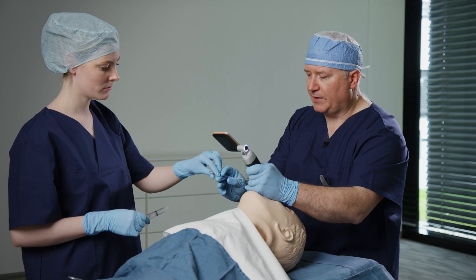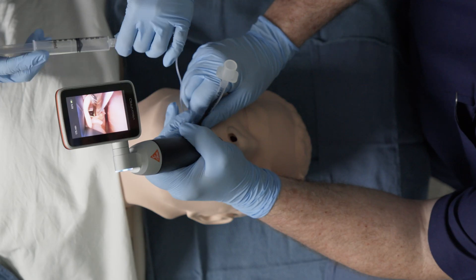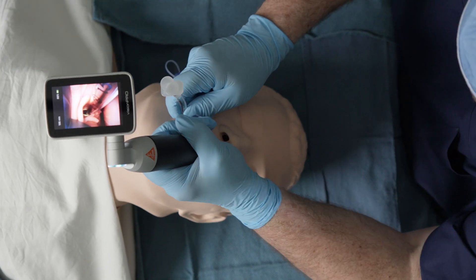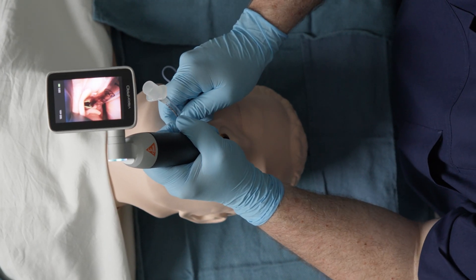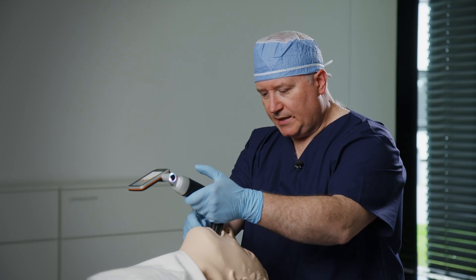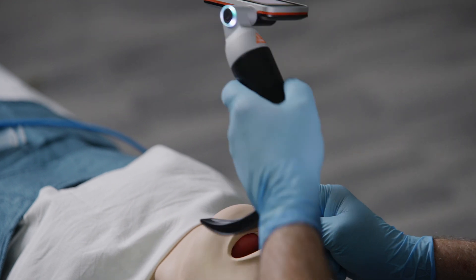Let's go ahead and place some air into the cuff of the tracheal tube. I'm going to double check the position on video to confirm I don't have an esophageal intubation. Now I'll just very gently rotate the laryngoscope out of the oropharynx.